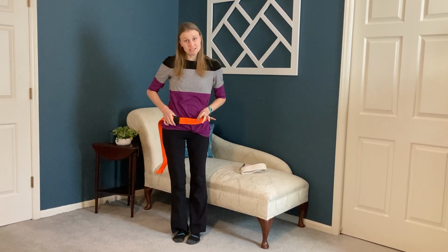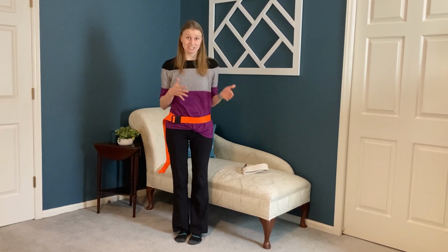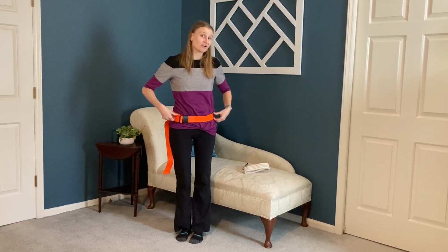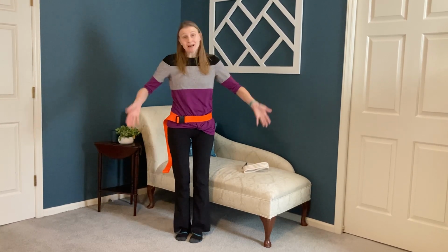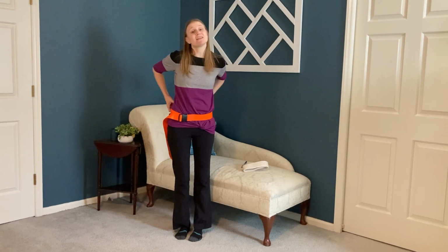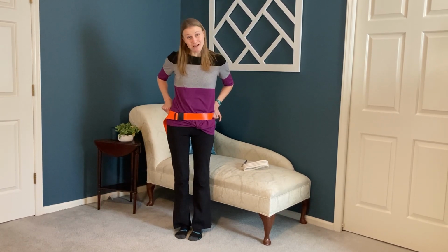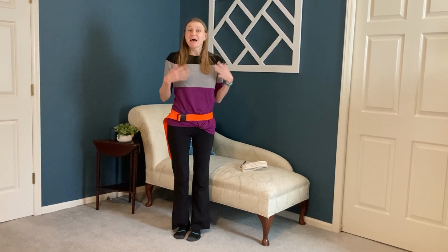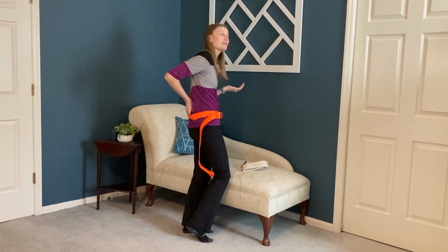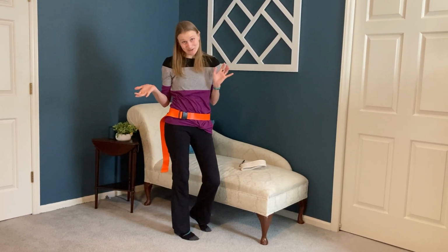What I will use this gait belt for is if I am helping someone with stability for balance when they're standing or walking. So during a transfer, I may have that gait belt on the person so it's ready to go. I might lift that person using my hands, but then I can transfer over to that gait belt once we're standing if they need some help with balance. If I'm walking with someone in the hallway, I also prefer to use a gait belt. I don't want to be walking behind someone with their pants bunched up in my hands, because that's not very cute if you're walking around in a retirement community.